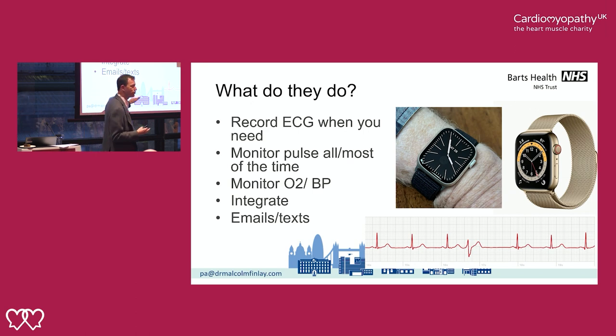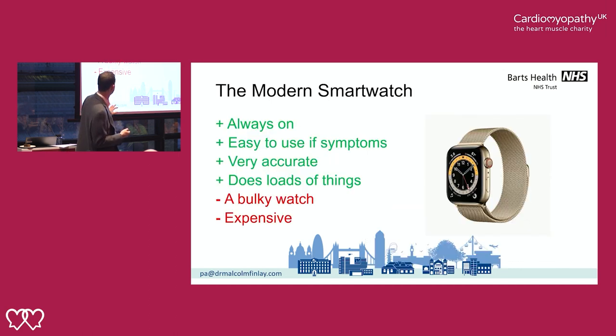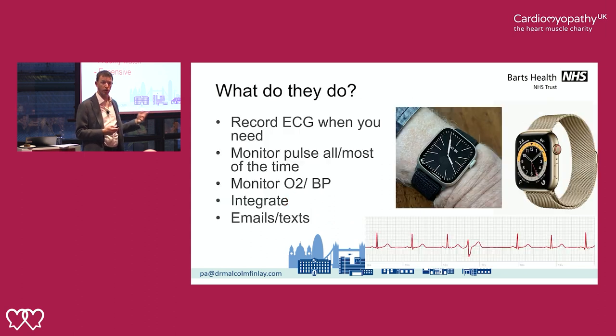But look, this is the standard of this recording. Everyone sends me this kind of trace where I can really tell what's going on. This one's from the Apple Watch, but it's just as good from the other watches with an ECG. You massively reduce the interference problems with the watches. So generally we get great tracings and generally they're diagnostic, even when the packet says this is not a diagnostic medical device.